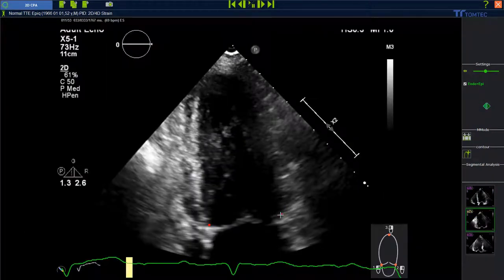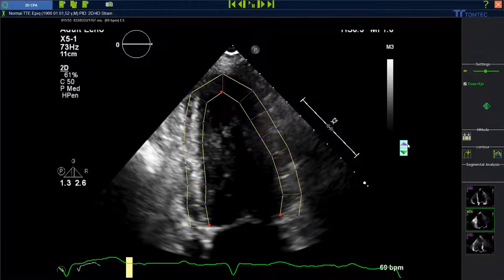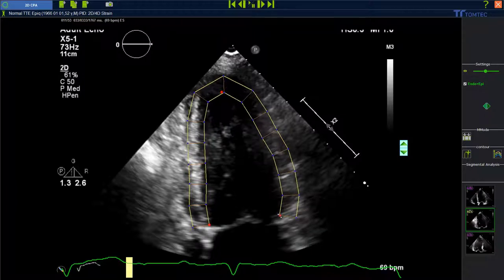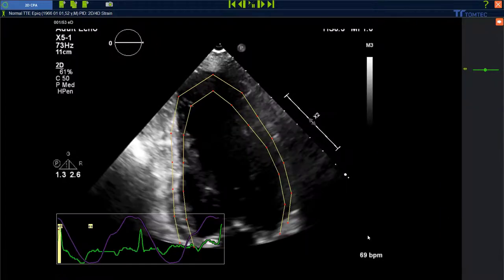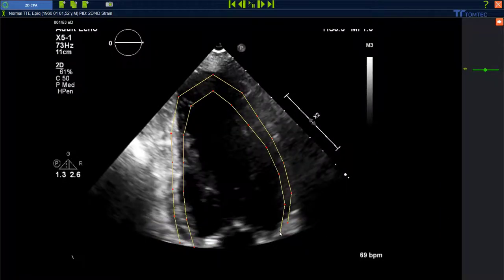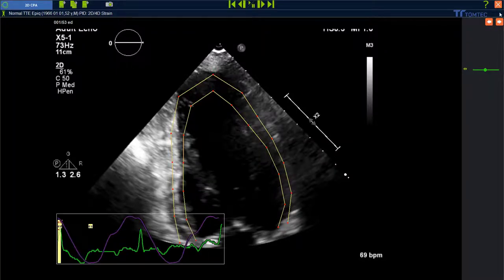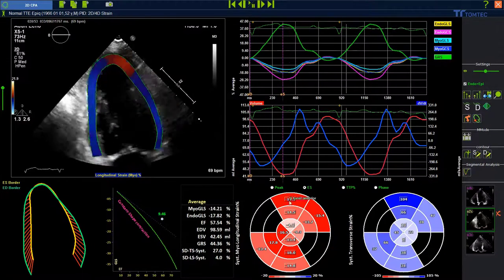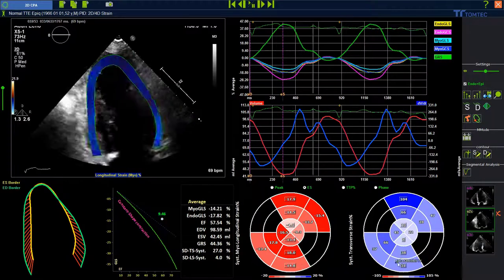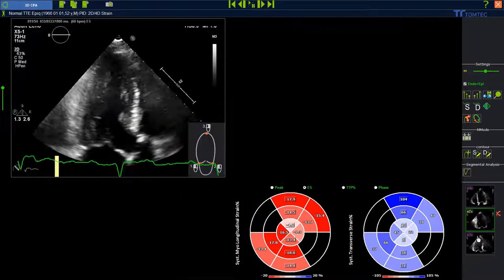From here, it's the same workflow for all the different planes. We have to set the points as described, make adjustments at the red dots, start the analysis, and wait for the end diastolic phase. Make adjustments if necessary and accept the changes on the upper right side by clicking the arrow. The next six segments are now visible.